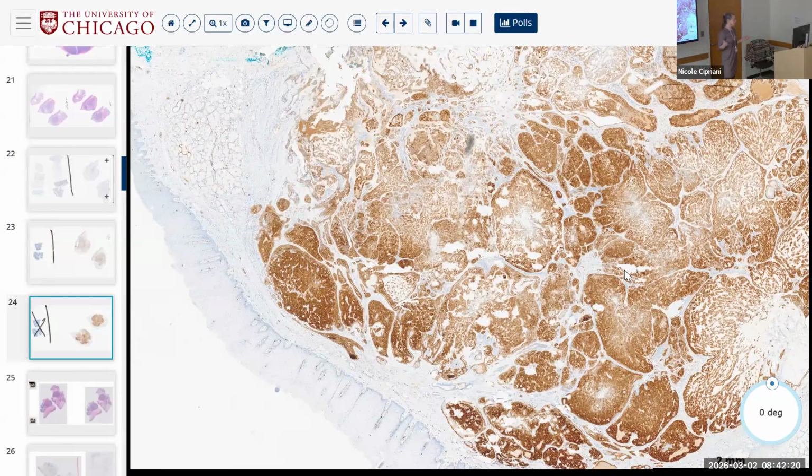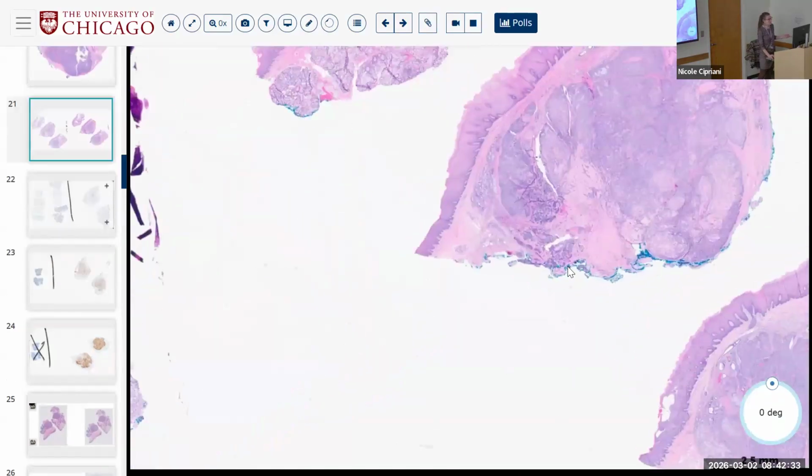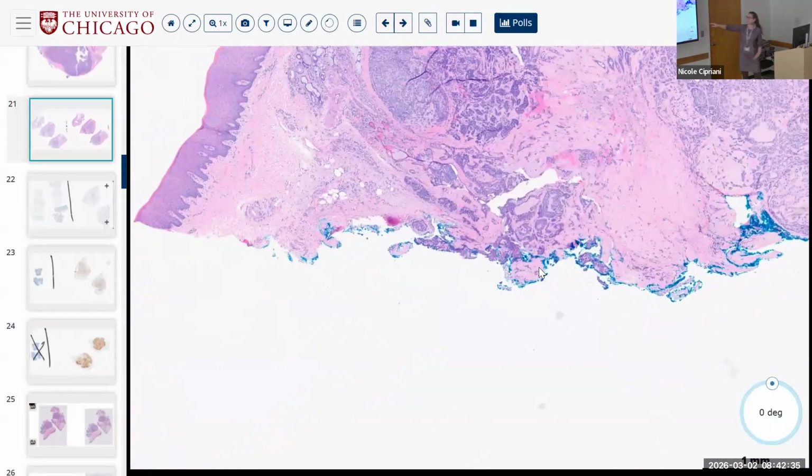Does it matter if I call this a low-grade, likely monophasic salivary neoplasm with a positive margin? Probably not. They're probably going to treat it the same. They're probably going to have to, however, if you're now calling it a carcinoma, they'll probably go back for this margin. If you're calling this a pleomorphic adenoma, they might not. They might watch and wait, right?